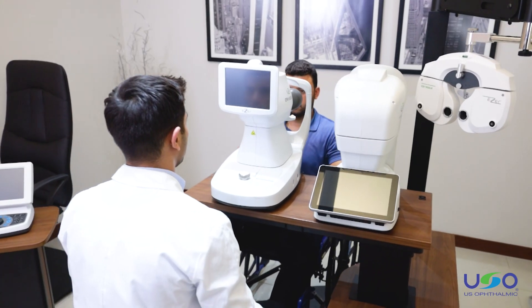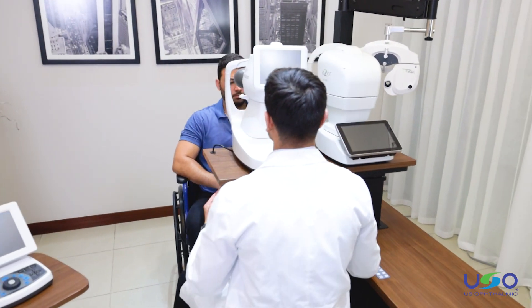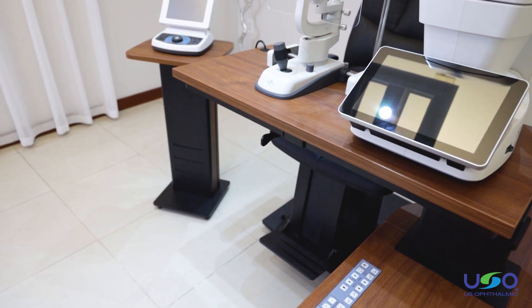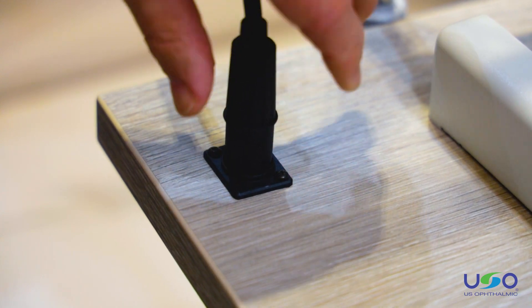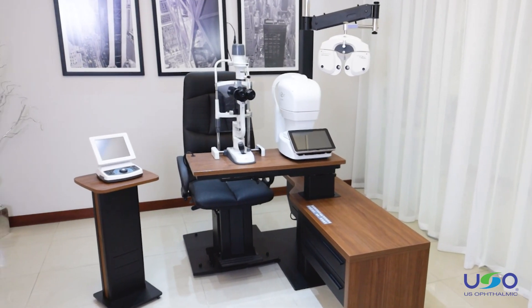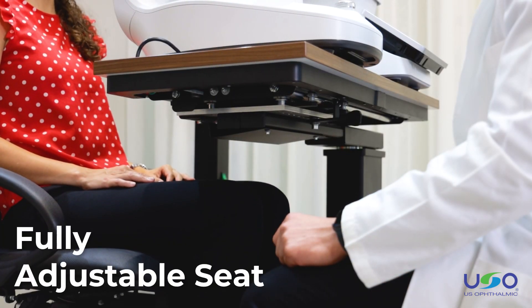The adjustable table is useful for when the doctor wants to fine-tune the table position without shifting the chair. The design also features slots on the table for sleek cable and wiring needs, so connecting exam equipment is simple and does not detract from the modern, clean look of the unit.